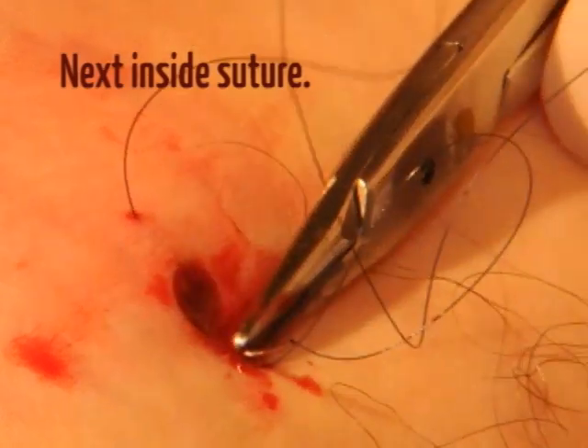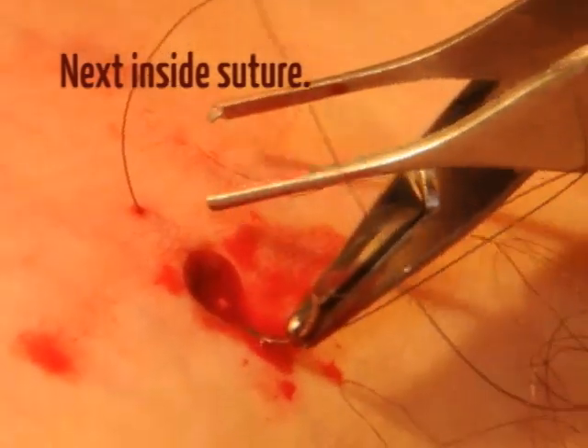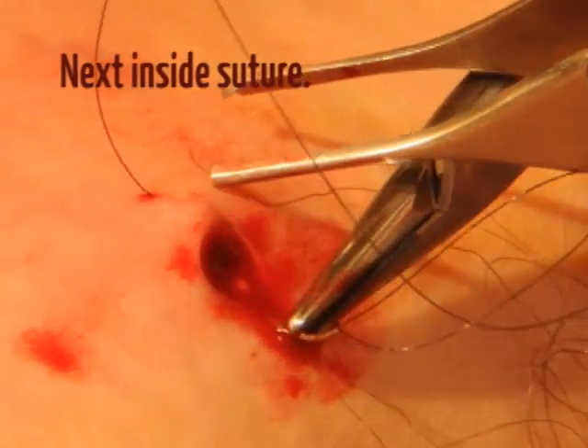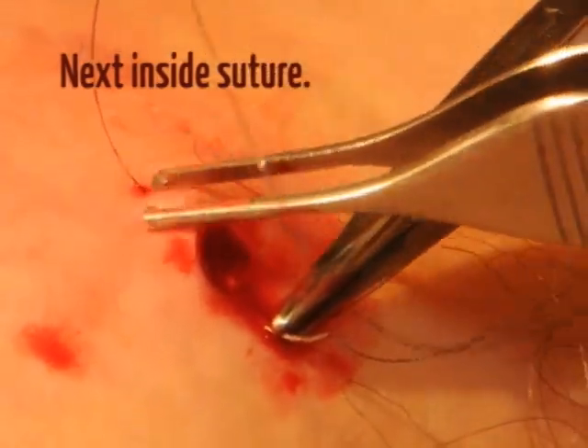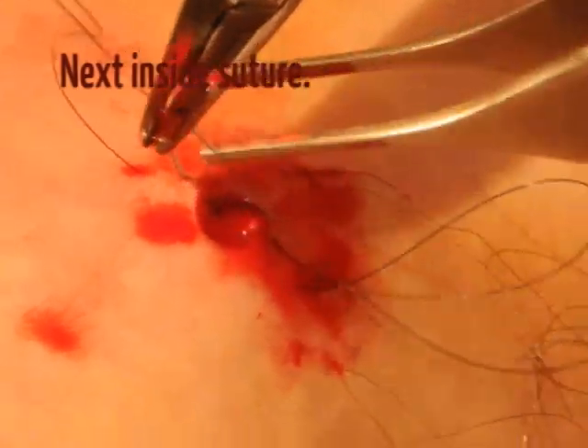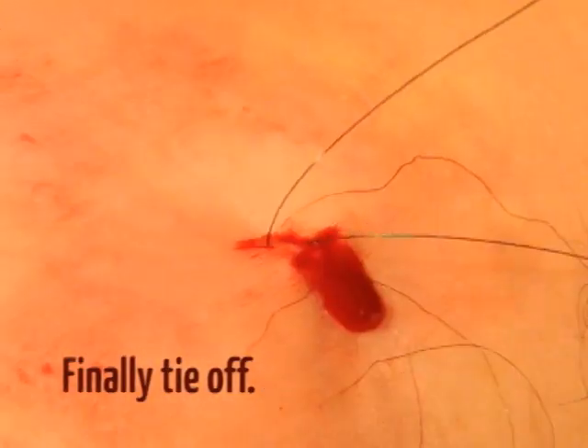Reverse the needle so it points back to the side the suture started on. Enter the skin 1 to 2 millimeters from the wound edge, then come up on the opposite side at the same 1 to 2 millimeter distance from the wound edge. Finish by tying the suture ends together.